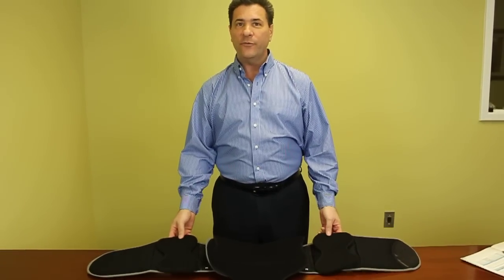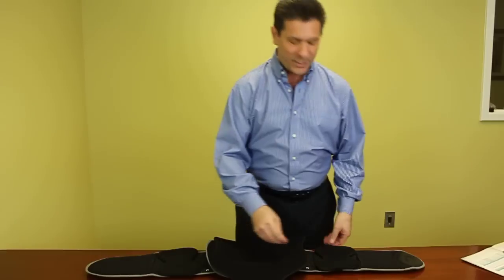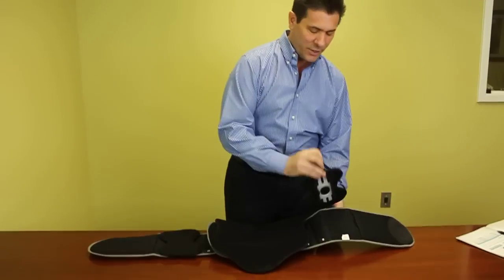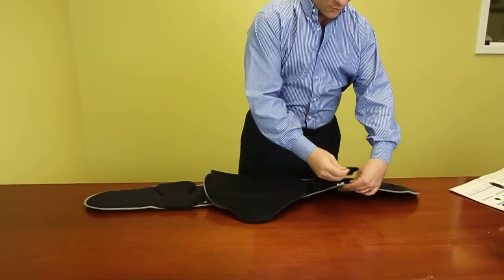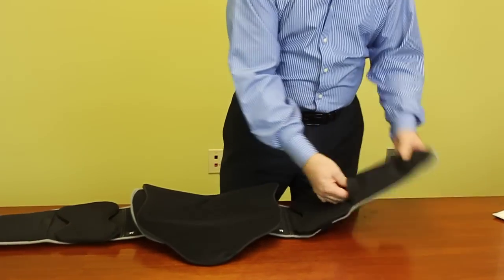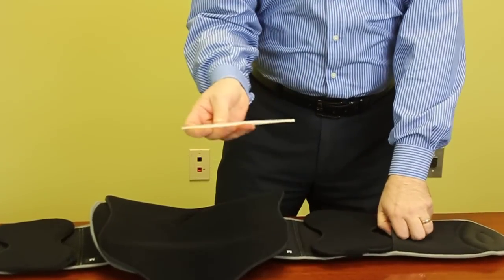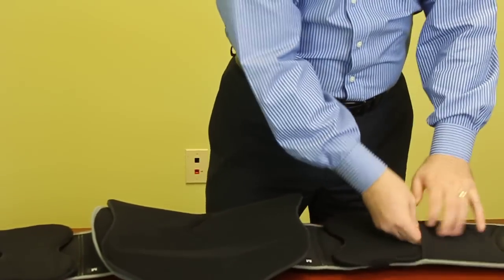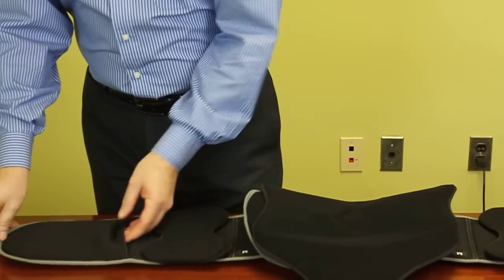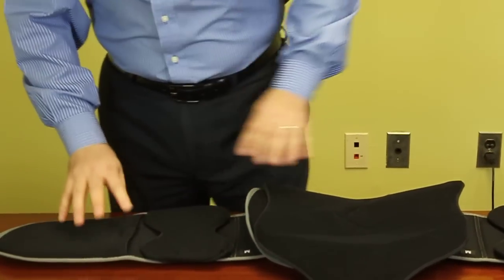A couple of the unique features of this particular device is that it has the removable side paddles, as you can see here — just Velcro straps that go around the belt itself. We have the side straps inside the belt area, the removable plastic straps or braces, and the front panel here. These are also removable, as you can see.